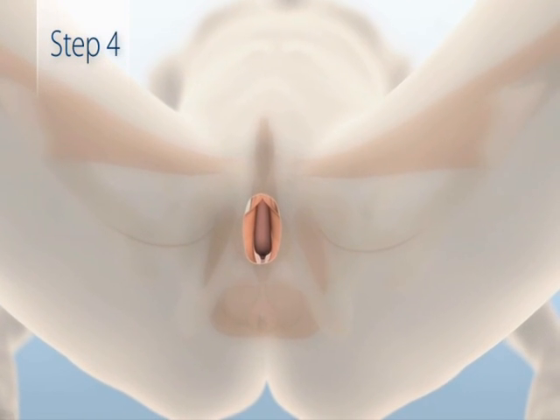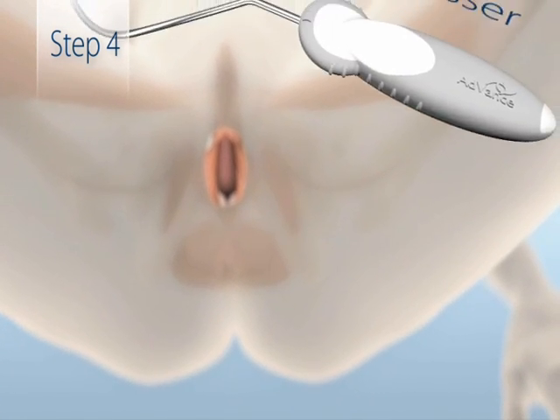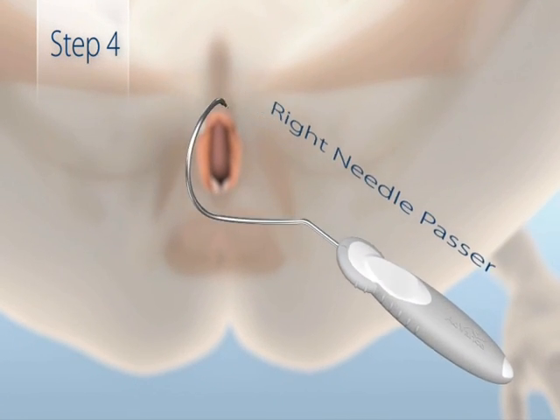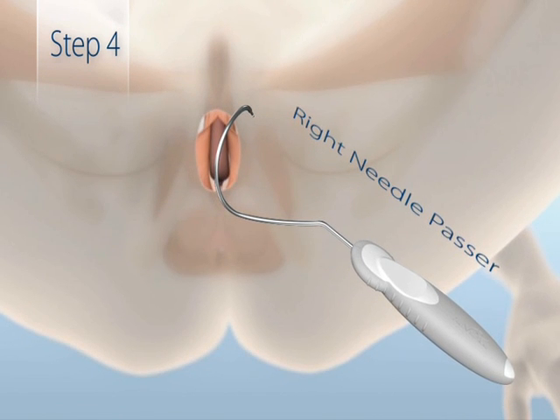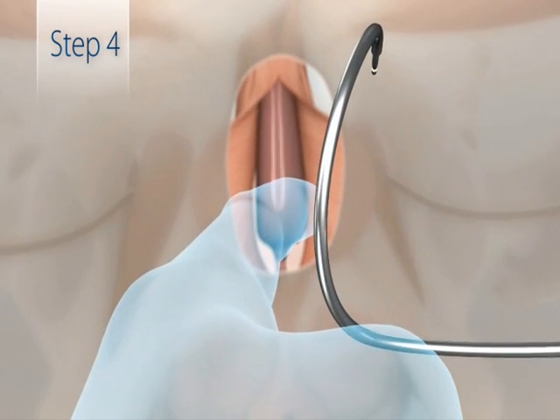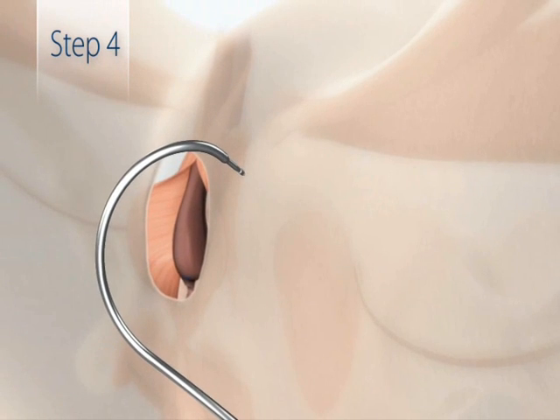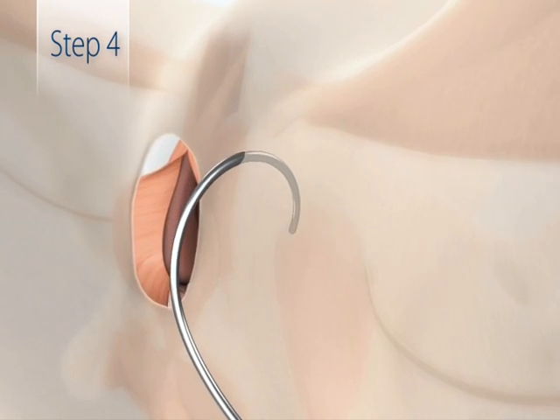The first step in sling placement is to insert the Advance XP needle passer. To insert, hold the needle passer at a 45-degree angle. Place a finger of the opposite hand into the perineal incision to receive the needle and protect the urethra. Insert the needle tip straight through the obturator foramen.